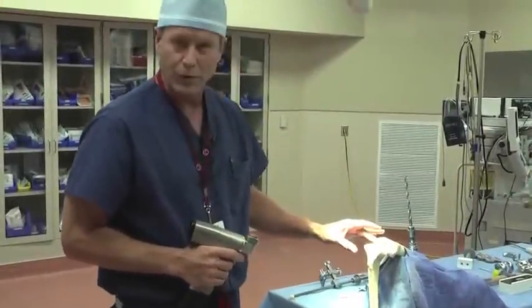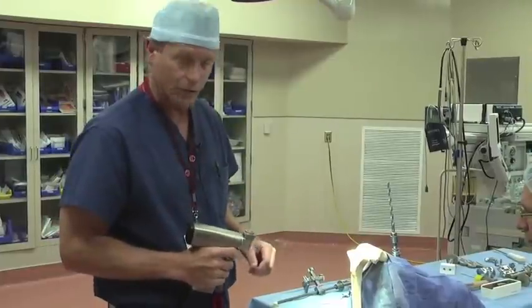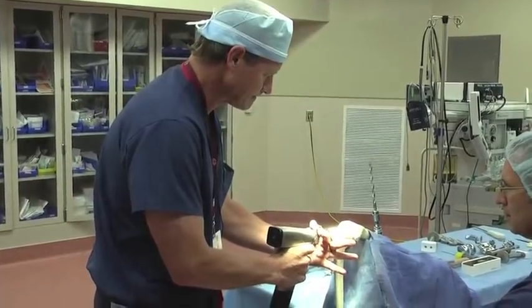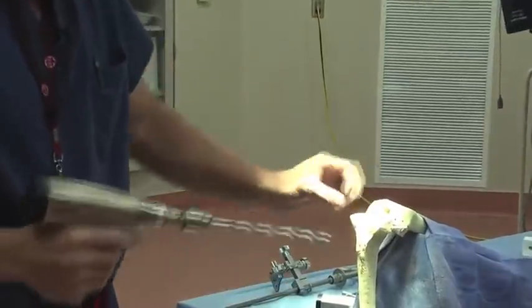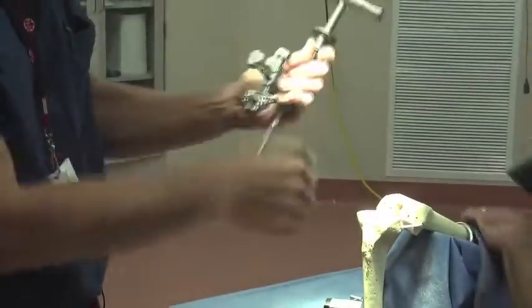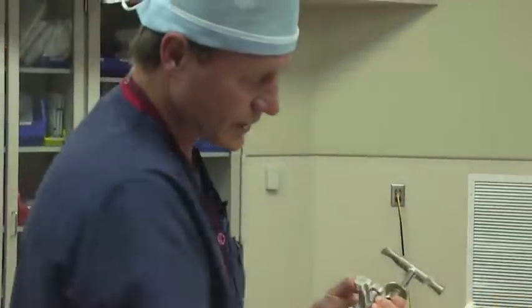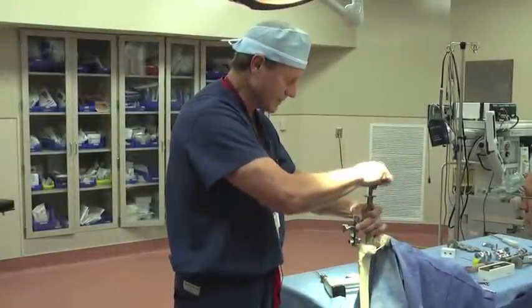We then bring the tibia forward and start to prepare that. This is just a personal preference of mine — I like to take off the tibial spines to make it flat where I can drill the next drill in. Now we're working on the tibial side. Once I have a good flat surface to work with, we'll come in and actually put our drill in again for a rod. We'll use an intramedullary rod — there are several different ways to do this; you can use an extramedullary rod, but I like using the rods that go down the bone, as I think we get a little bit better read on the alignment we want.